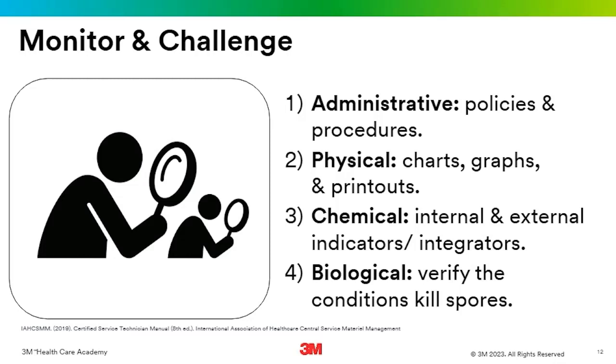Because that's the relationship of sterility. It's not just about watching it and creating the environment, right, for it to happen in. We have to challenge our devices to demonstrate sterility, right? So when we even get to the process challenge devices, we have different mechanisms in place that say, even if I give you everything you need, can you do what I need you to do? So having a variety of ways to monitor and challenge our sterilizing devices to show that they're working is overwhelmingly important.